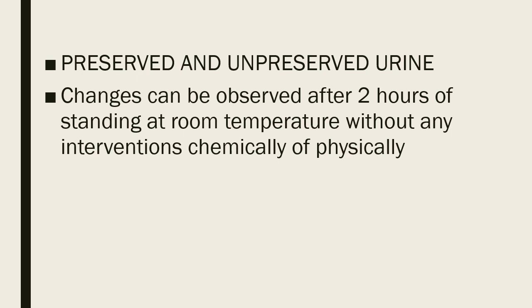And then of course, 2 hours after standing, changes can already be observed, like an increase in odor, a decrease in clarity, a decrease in glucose, and the rest of the analytes to be tested in your urine sample.